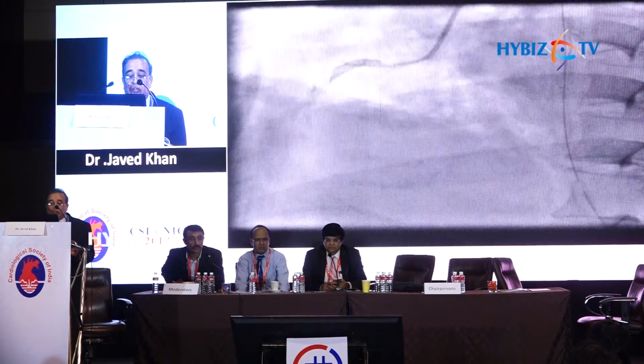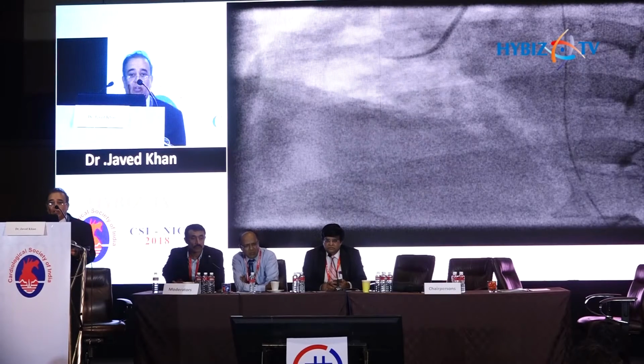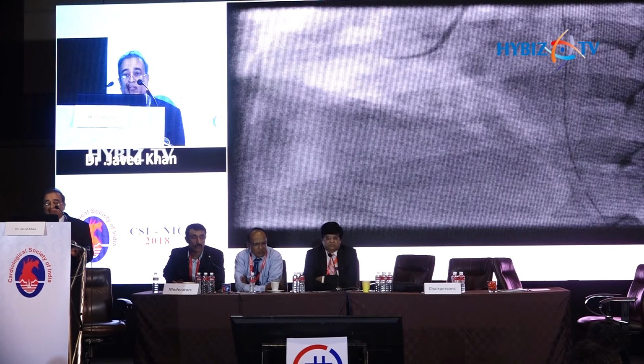Then we thought it might be the right coronary artery, because we had taken a diagnostic shot in the right coronary artery. Had we done something wrong in the right coronary artery or not? So we have taken a diagnostic shot in the right coronary artery. But unfortunately, nothing was found.